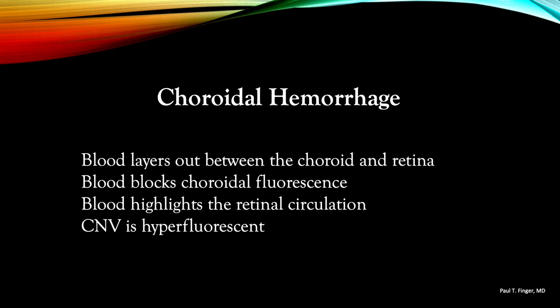Let's take a look at another choroidal tumor: choroidal hemorrhage. I'm sent a number of choroidal hemorrhages over the year to rule out choroidal melanoma. Choroidal hemorrhage is not a malignancy — it's just blood. However, some rare choroidal melanomas can also present with choroidal hemorrhage. In general, blood layers out between the choroid and the retina. That blood blocks choroidal fluorescence and highlights the retinal circulation, much like RPE hypertrophy. Any CNV that is synchronous with the choroidal hemorrhage, or may even be etiologic, is hyperfluorescent.